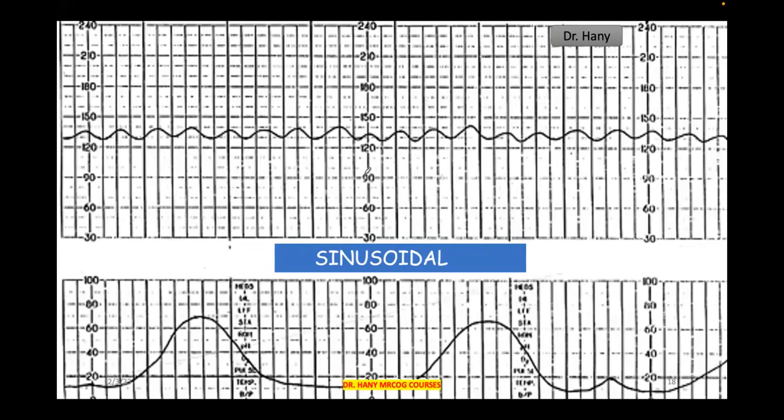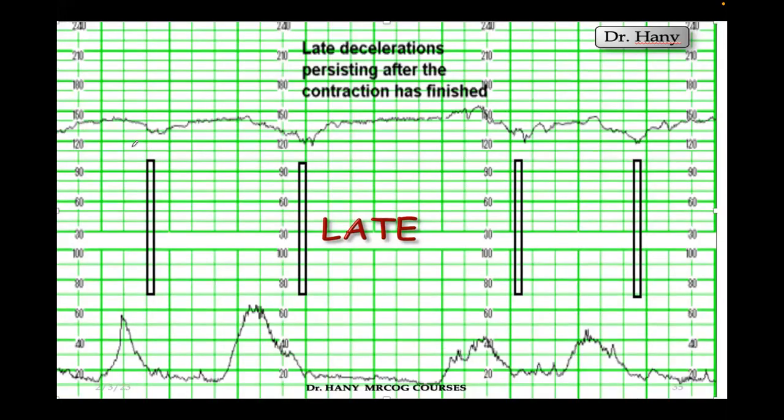This is a pathological CTG. Why? Sinusoidal pattern. Can anybody tell me whether this is a pathological or suspicious CTG? Classify the decelerations. What is this?